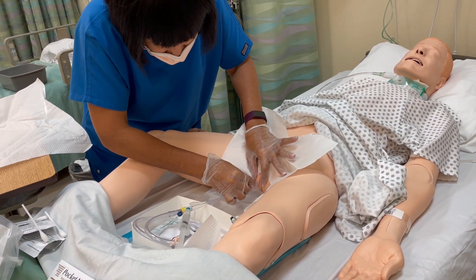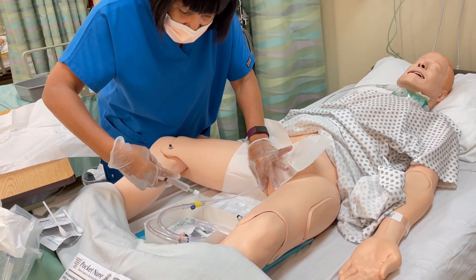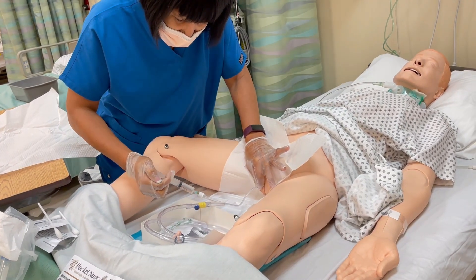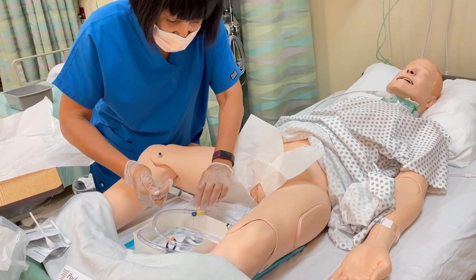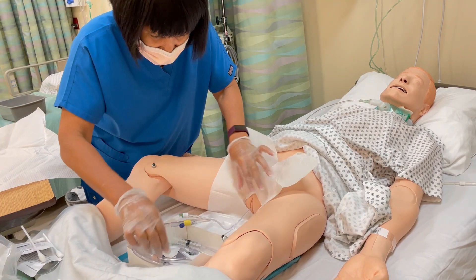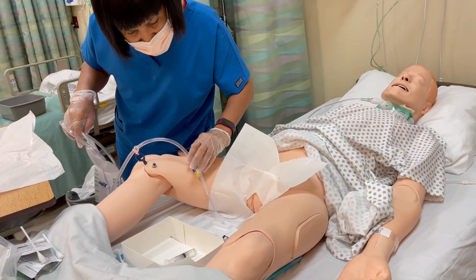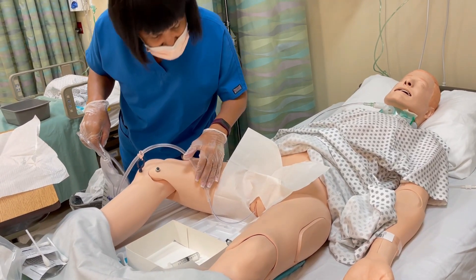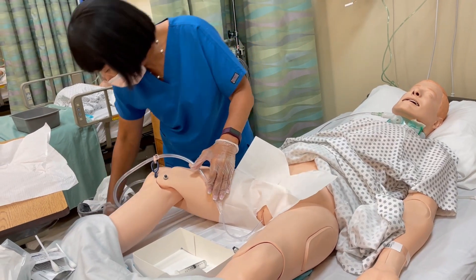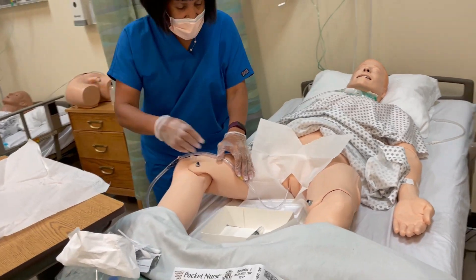Urine is coming back. I put it an inch and a half further up. There — hold it. I'm going to put my fluid in. Fluid going in. Good job. And then I take it off here. Now pull it further down to make it sit at the neck of the bladder. I'm going to take it here on the side of your leg so you can move around and don't feel uncomfortable. I'm going to put the bag at a non-movable part of the bed.